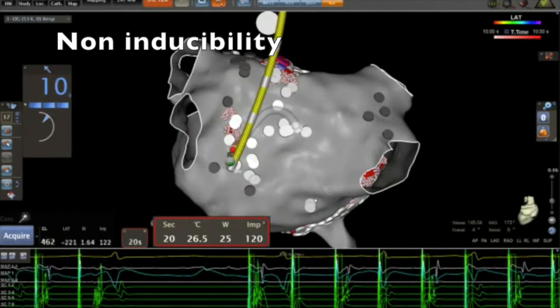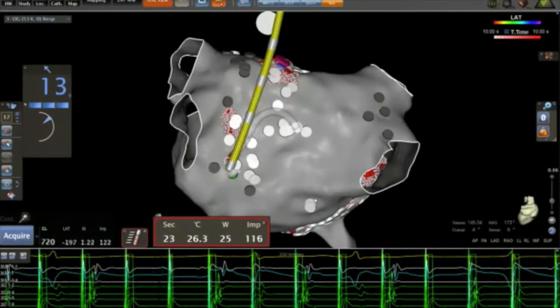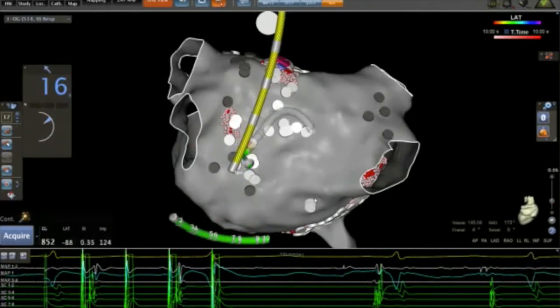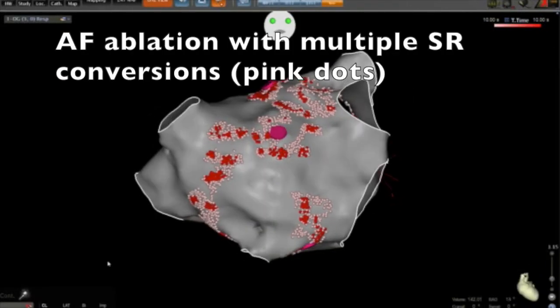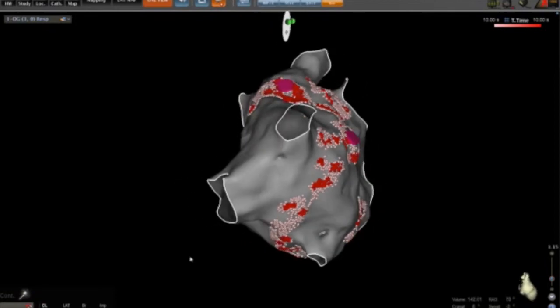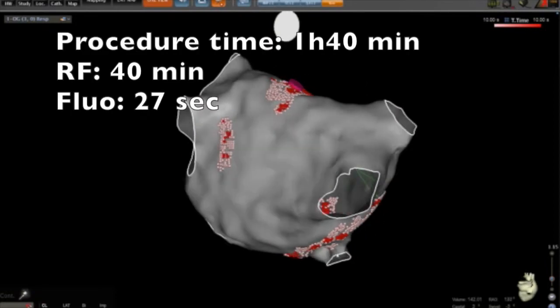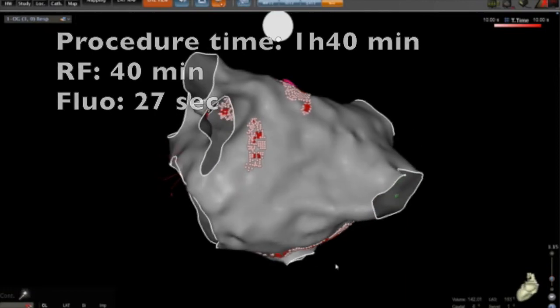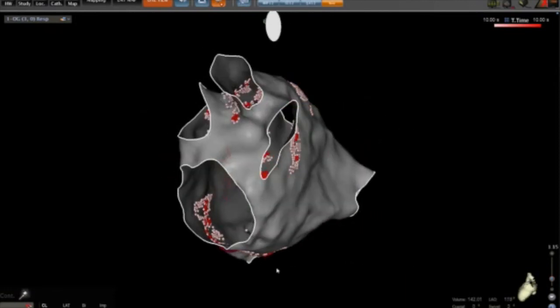We try to re-induce AFib again, and you can see that AFib is not inducible anymore. You can see here the ablated areas on the left atrium, the pink dots corresponding to the sinus rhythm conversion spots, and almost no ablation was performed on the posterior wall of the left atrium.